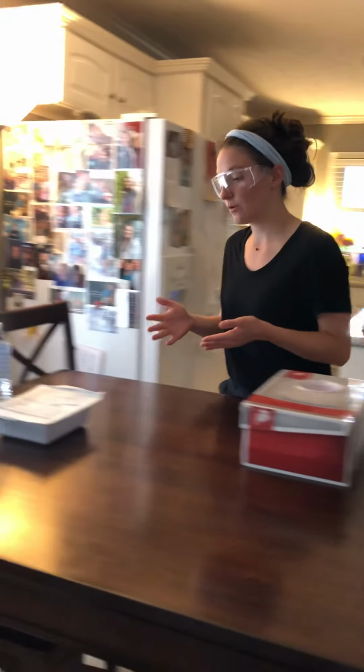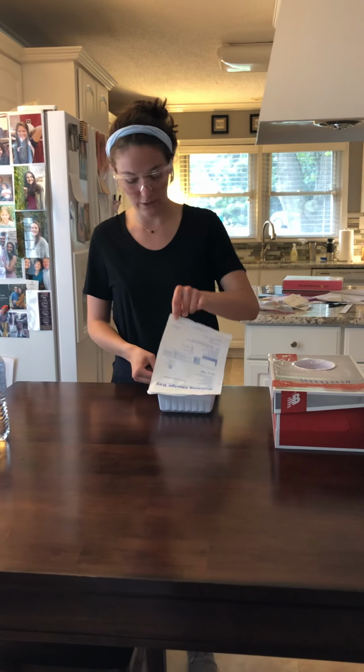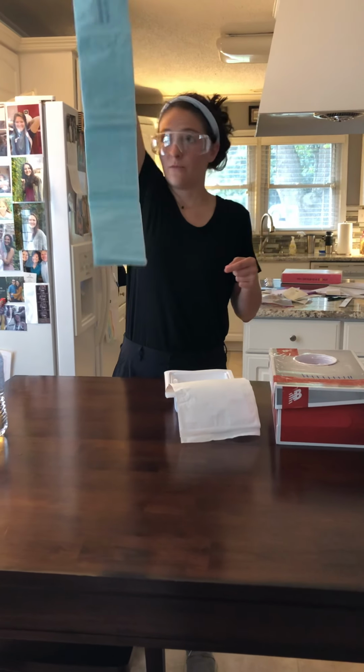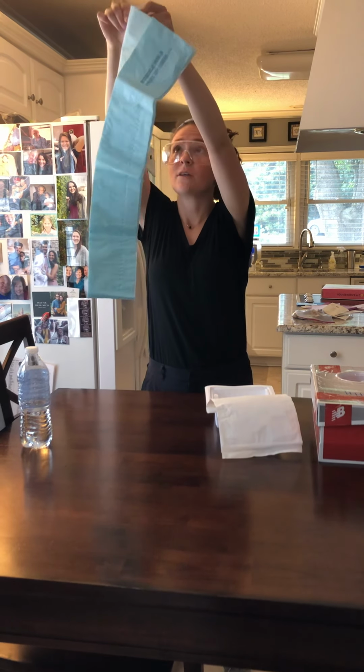Now I'm going to set up my sterile field with my dressing change tray, only touching the outside 1 inch of the box. I'm going to take that out and tape up my sterile field, and only touching the 1 inch border.